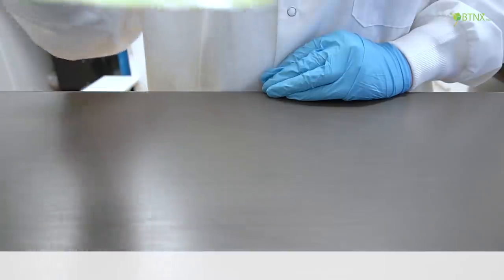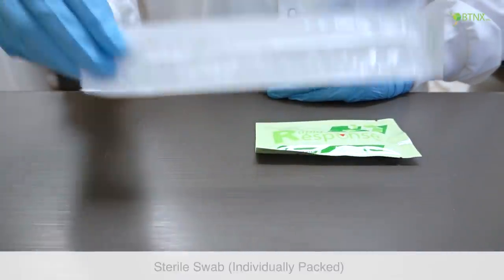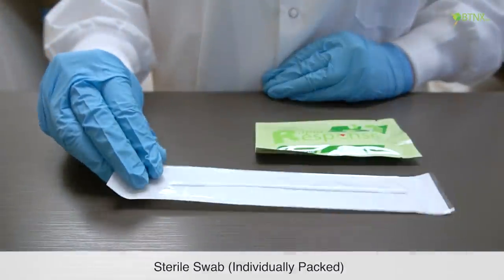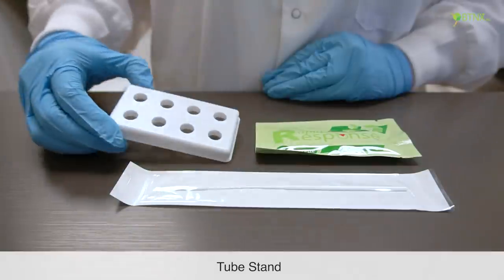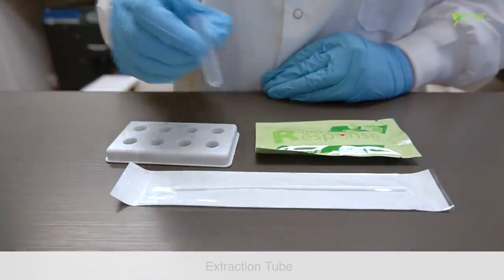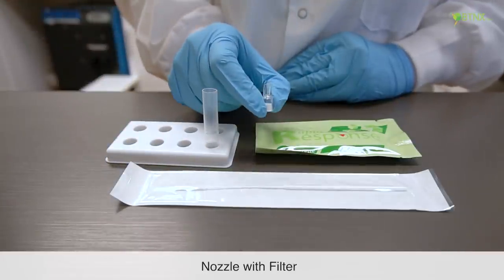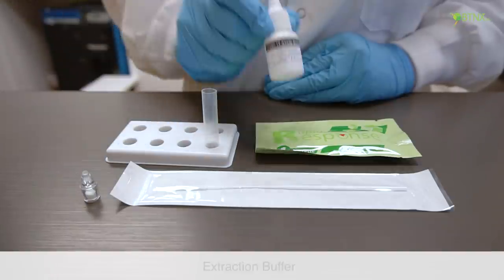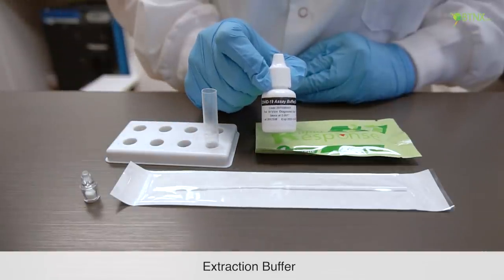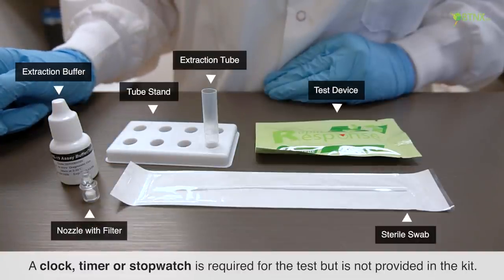The test kit contains a test device, a sterile swab, a tube stand, an extraction tube, a nozzle with filter, and an extraction buffer. A clock, timer, or stopwatch is required for the test but is not provided in the kit.